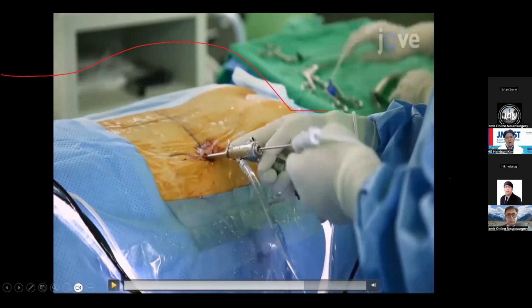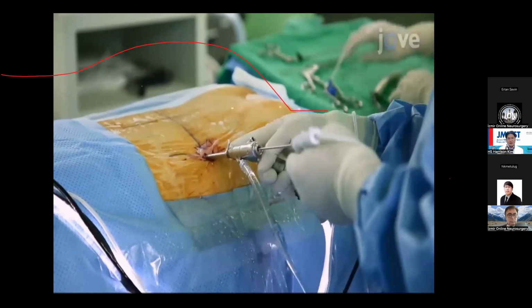You can see the working channel being mobilized. This working channel is not inserted into the blocking space, the intervertebral area, or the deeper foraminal area. Because of that, I can mobilize the working channel to the target point.